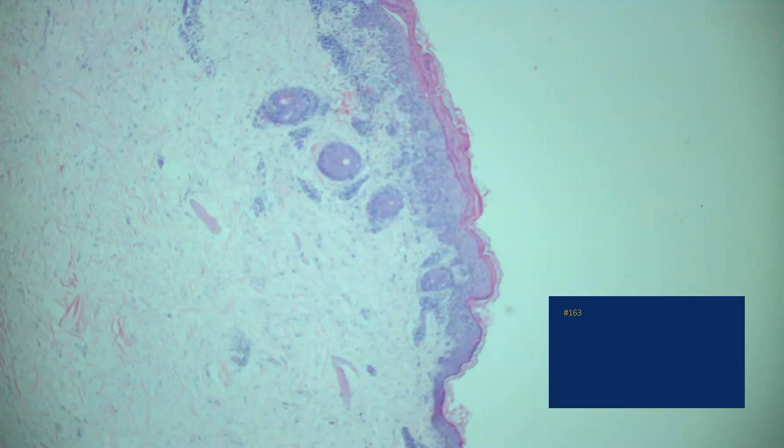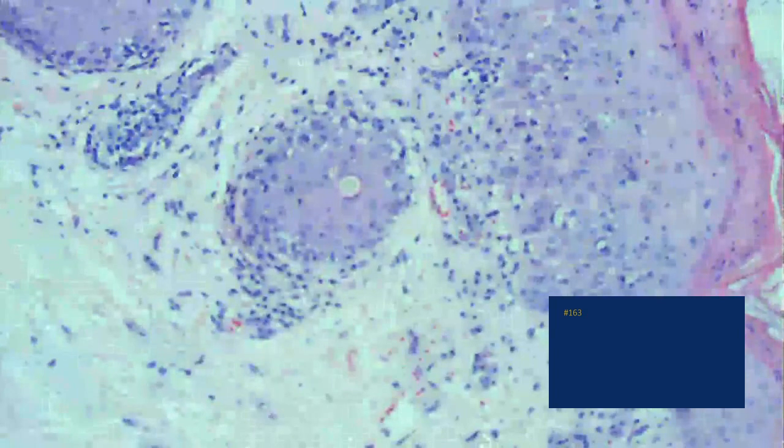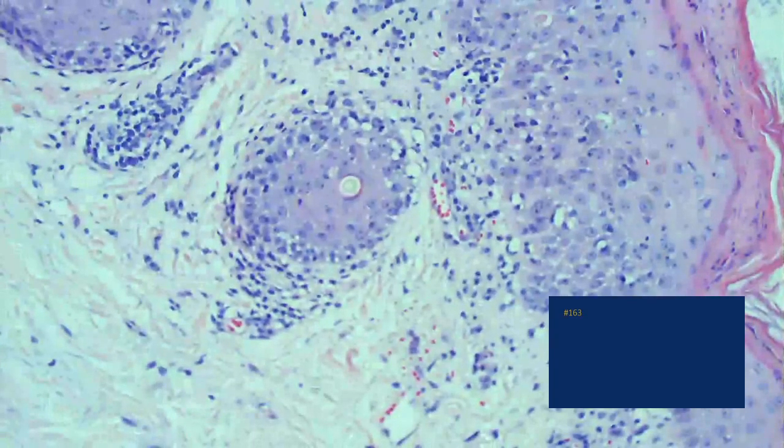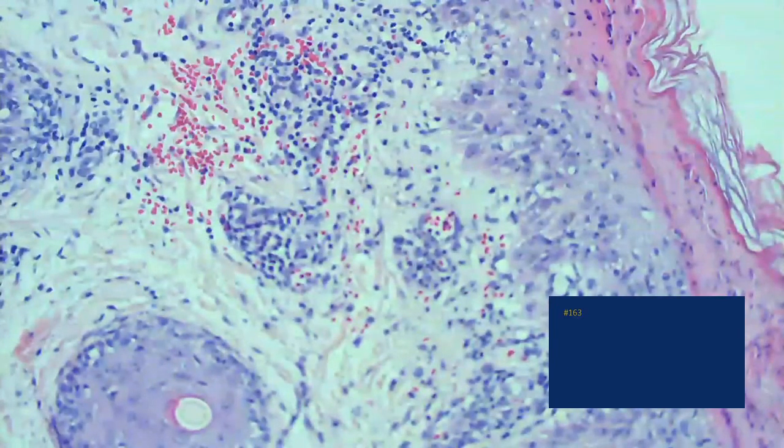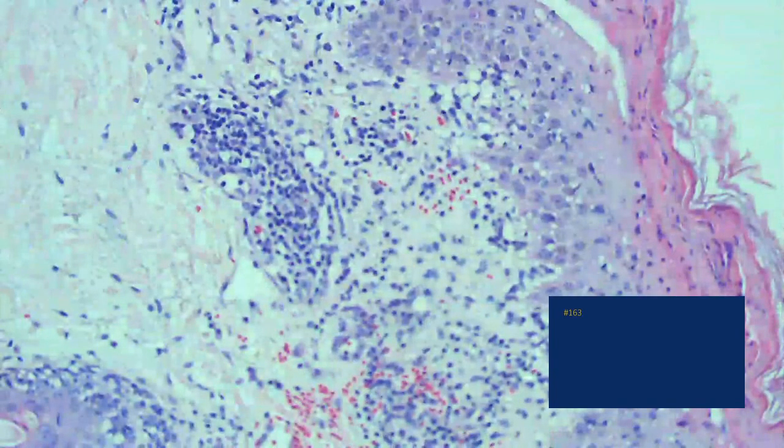There are several different forms in addition to the acute, subacute, and chronic form. There's a type that can be widespread and hemorrhagic, associated with febrile illness, and patients can actually die from this. So it's not always a benign process. One other teaching point, if you see eosinophils in what looks like Pityriasis lichenoides, you might be allowed one, but if you see any more than that, it's not Pityriasis lichenoides. It's either a simulator of it, maybe a drug reaction. Make sure it's not lymphomatoid papulosis simulating Pityriasis lichenoides, because that can simulate Pityriasis lichenoides histologically, and you can get plenty of eosinophils in that.